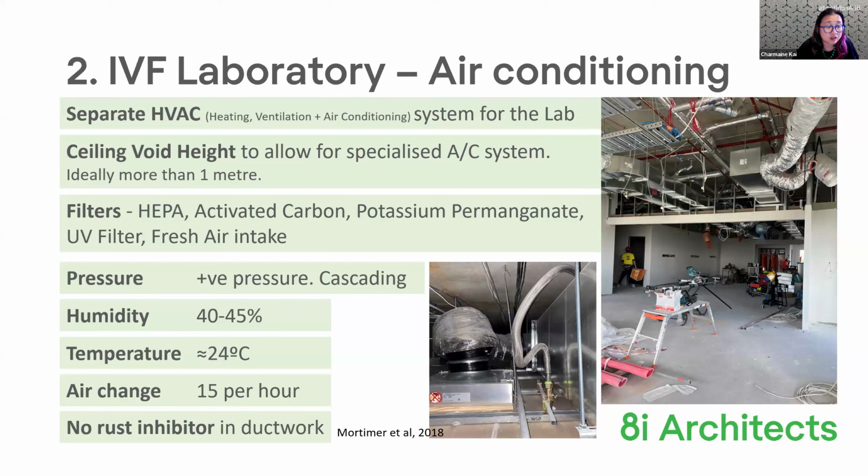So temperature in an IVF lab, we generally look around maybe 22 to 24 degrees Celsius. What we try to do in an IVF lab is not make it too cold, so that it's closer in temperature to what body temperature would be. A lot of times we get a lot of feedback from the hospital staff, because hospitals like their operating theatres to be freezing, 16, 18 degrees.